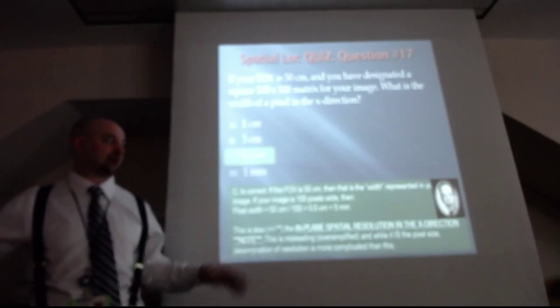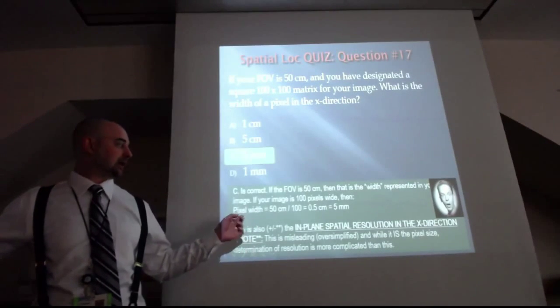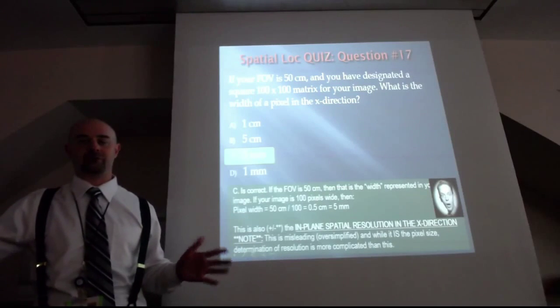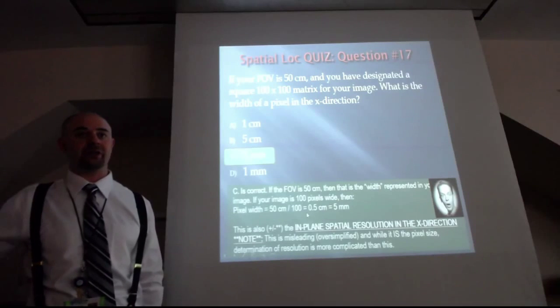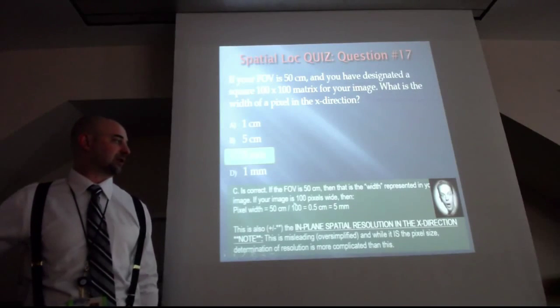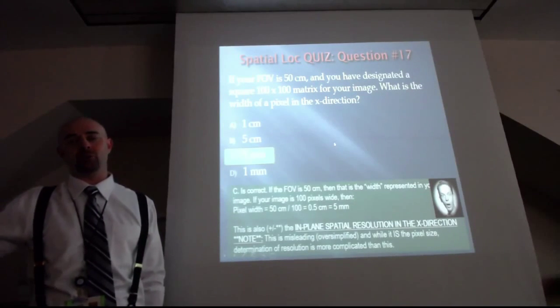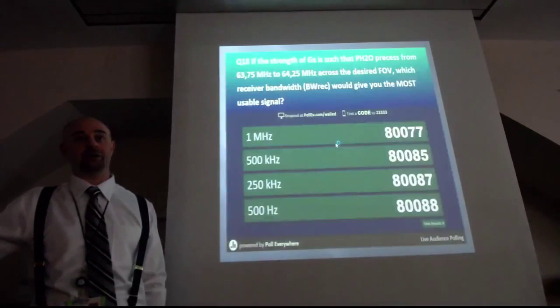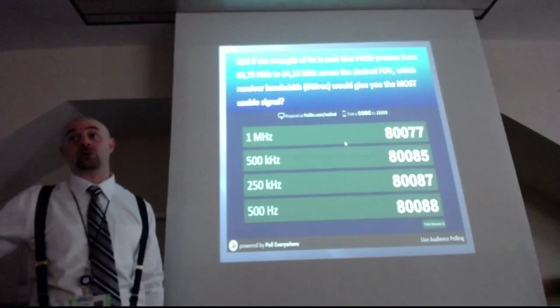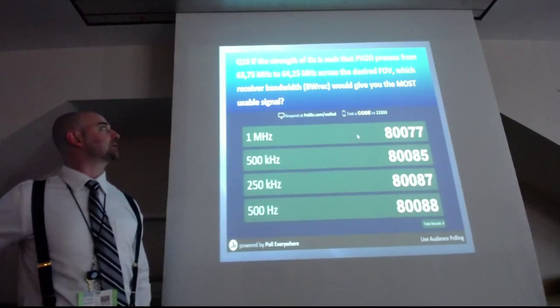Now remember I told you I was going to tell you when I was lying to you. I said it's the same thing as the in-plane spatial resolution. There's actually a much more complicated story to what in-plane spatial resolution actually is, so just be aware of that. But for superficial purposes, you can think of it that way, and it's fair game to ask you a question where that is actually the answer.